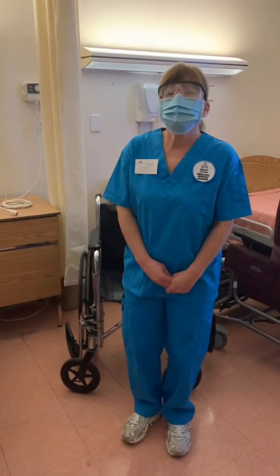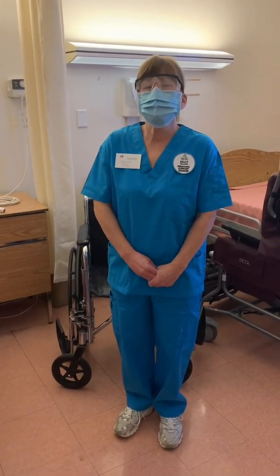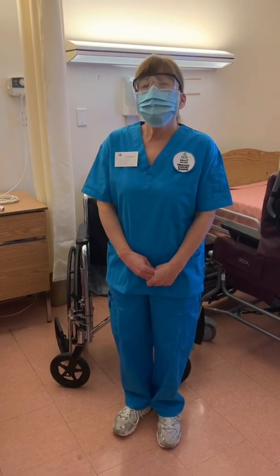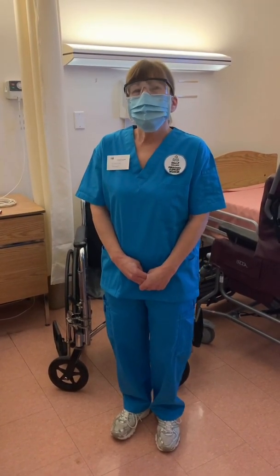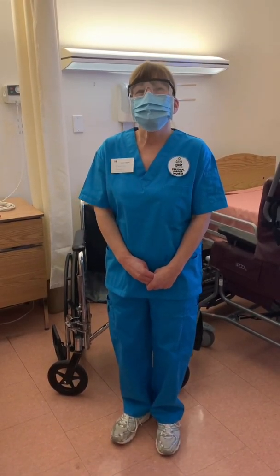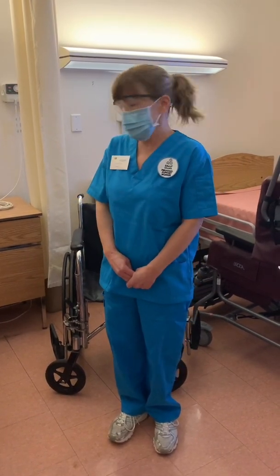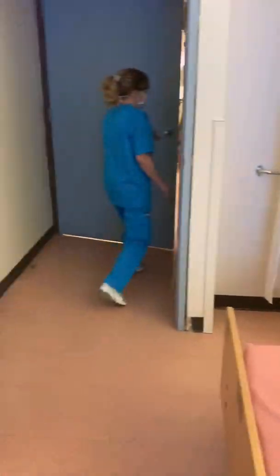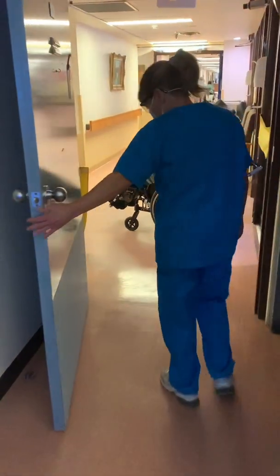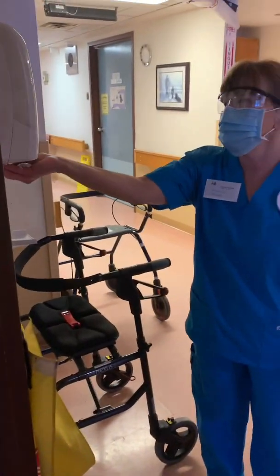I'm going to be focusing on the following things: health and safety, proper hand hygiene, and also proper body mechanics. And of utmost importance, I'll be focusing on the principles of DIPS, which is the dignity, independence, preferences, privacy, and safety of our resident. So we'll begin. I'm going to go outside and we'll begin now. The first thing I'm going to do is apply proper hand hygiene.